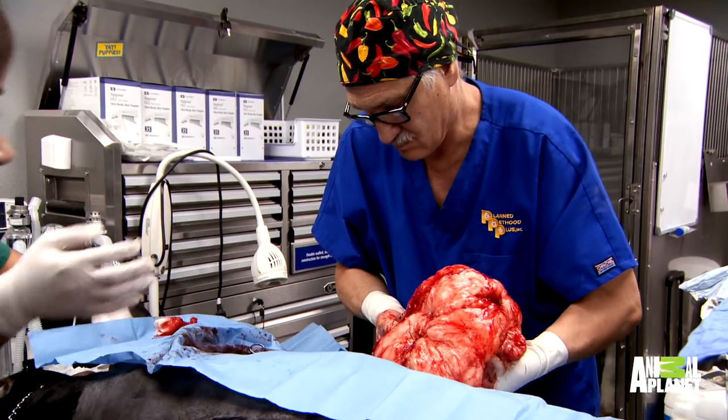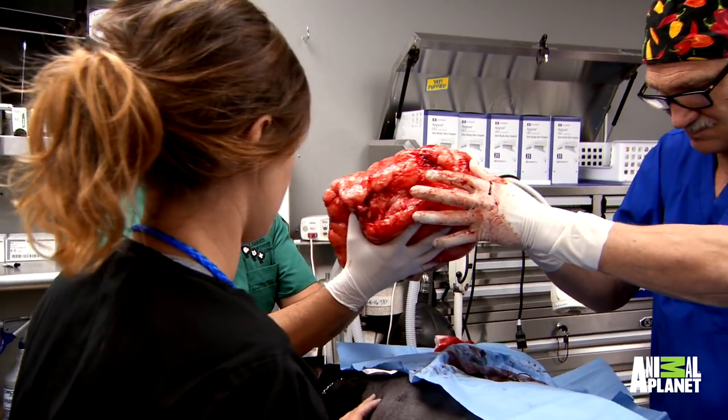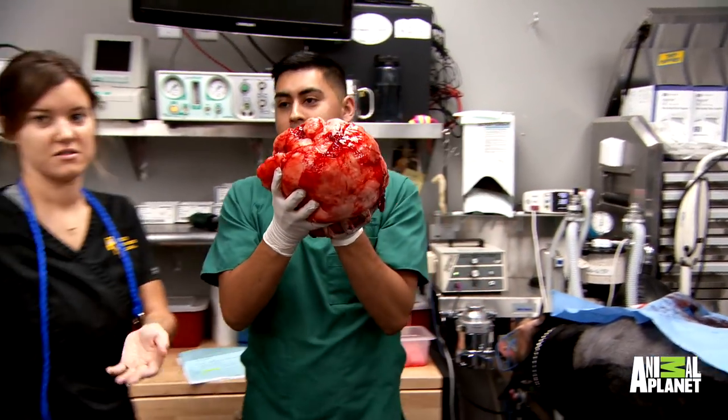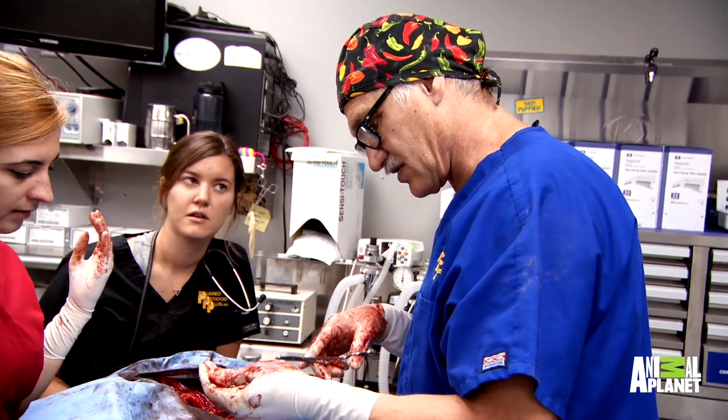You ready? Obviously, to be that size, Cinder would have had it for a while. The reality is these things can go incredibly fast in just a few weeks to months. The mass is gone. It was convex earlier, now it's concave. A lot of extra skin here, so we'll see.